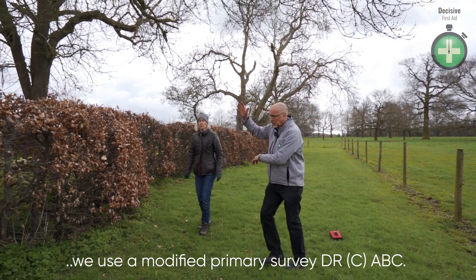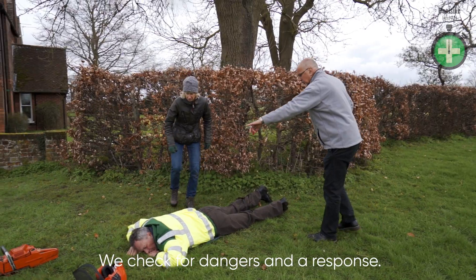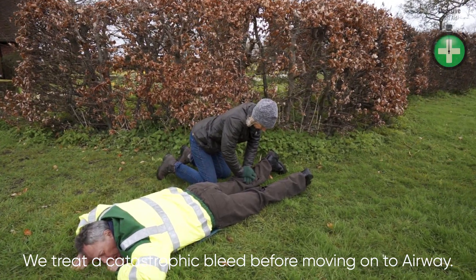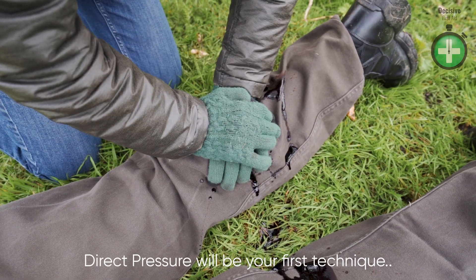We're checking for dangers. There are no branches that could fall. The chainsaw's well out of the way. Get direct pressure on to that arterial bleed. I'll go for the CAT bleed kit. Keep that pressure on.